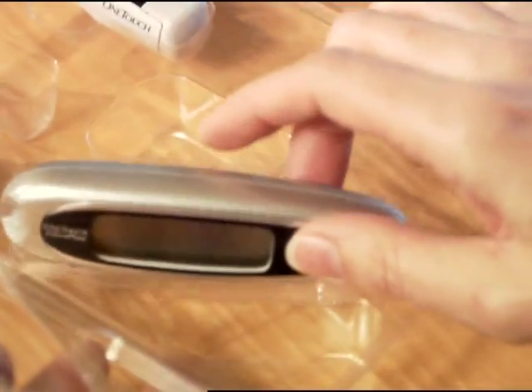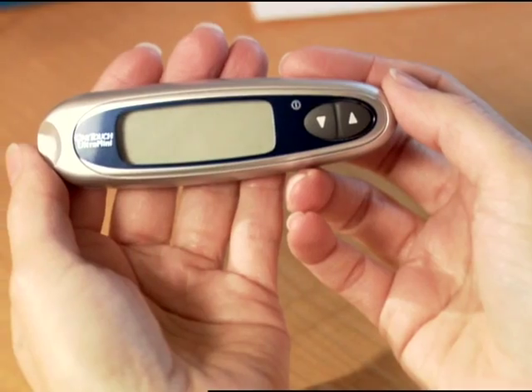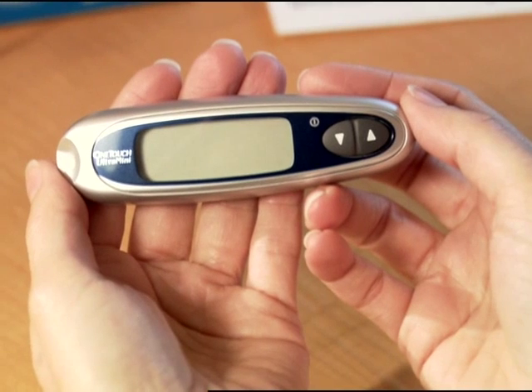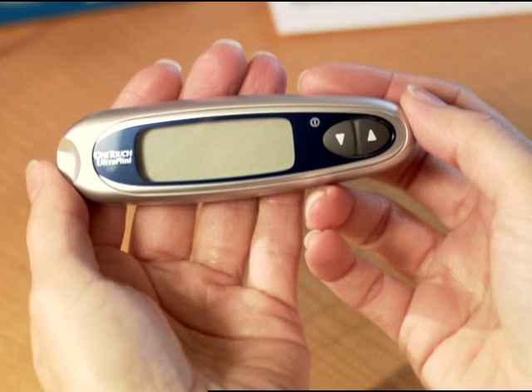Your OneTouch Ultra Mini meter comes with the battery already installed, so it's ready to use right out of the box. When reading information on the meter display, make sure to hold the meter like this, so that OneTouch Ultra Mini is to the left of the screen.